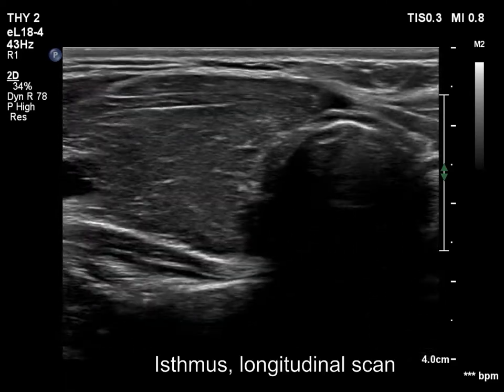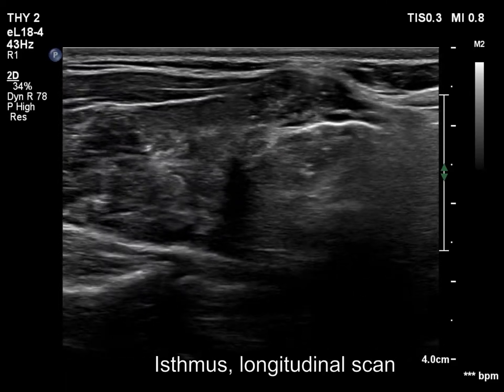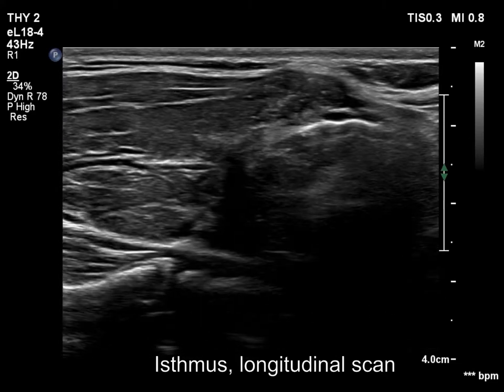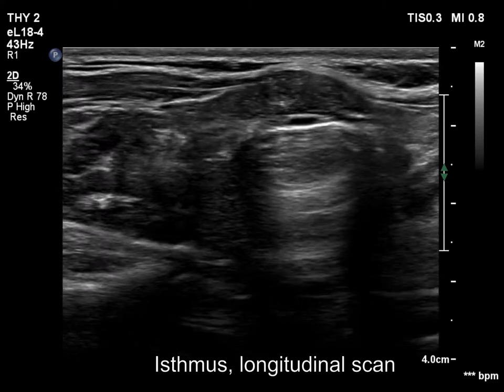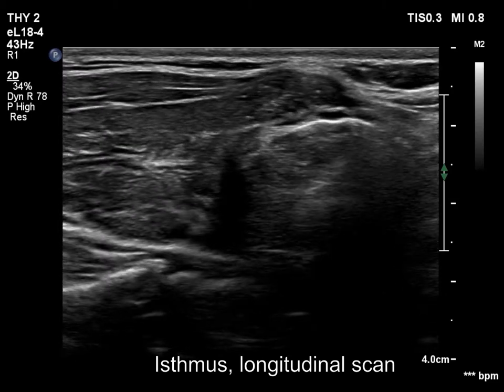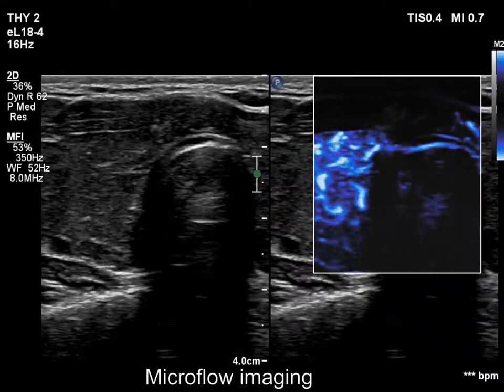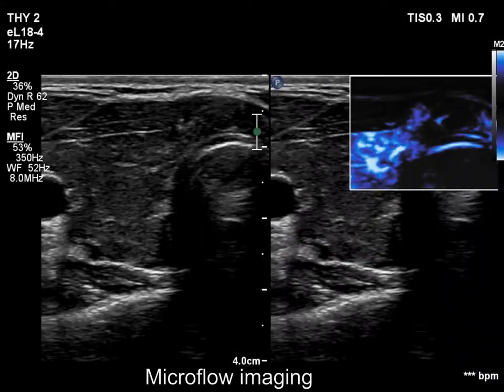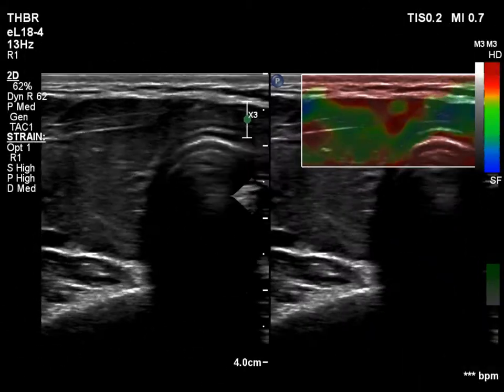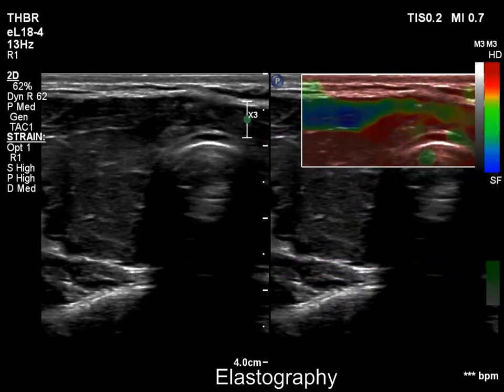There is a more hypoechoic discrete lesion in the isthmus which, in contrast to other parts of the thyroid, presents predominantly echogenic granules. The lesion is avascular. The elastography pattern is equivocal.